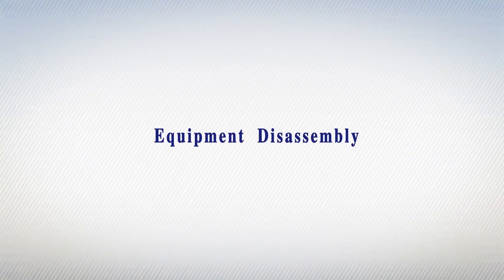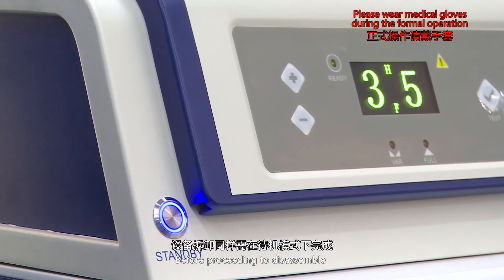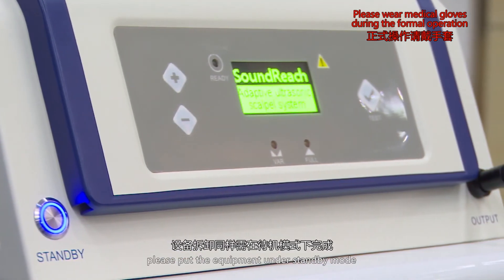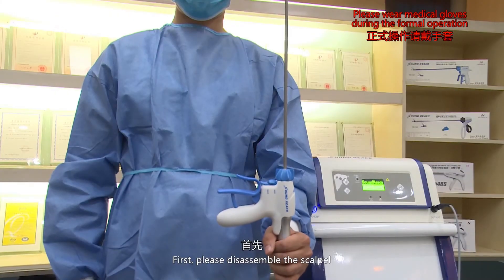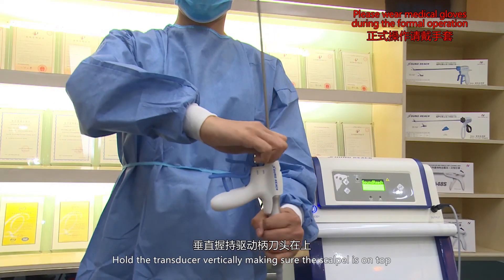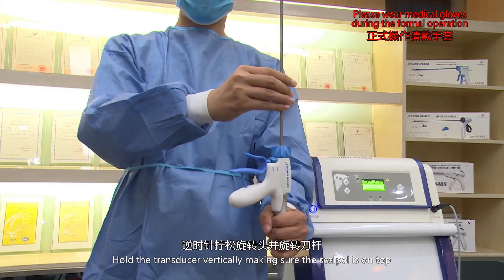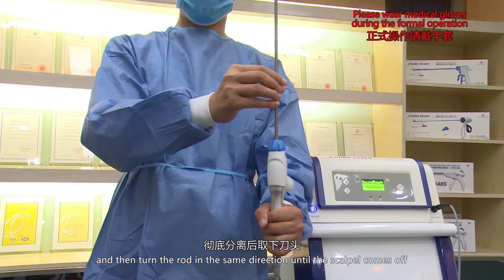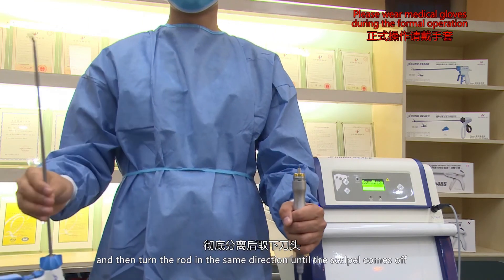Equipment disassembly. Before proceeding to disassemble, please put the equipment under standby mode. First, please disassemble the scalpel. Hold the transducer vertically, making sure the scalpel is on top. Turn the wrench knob counterclockwise and then turn the rod in the same direction until the scalpel comes off.